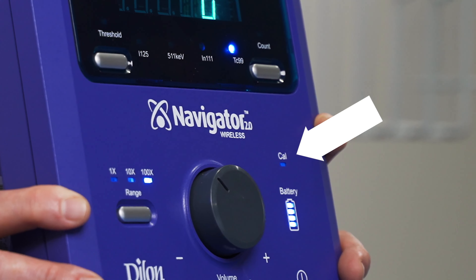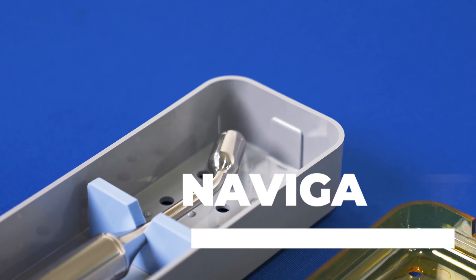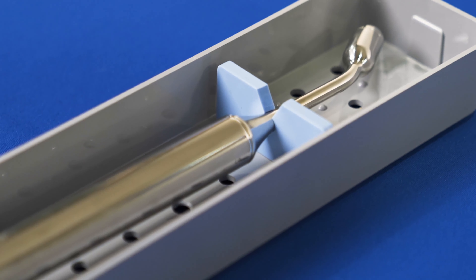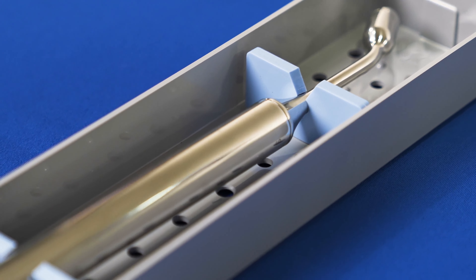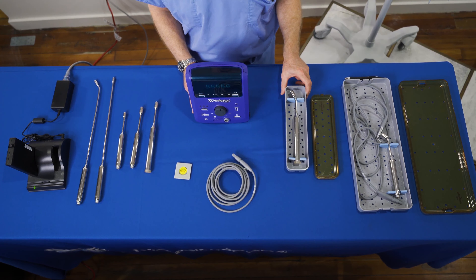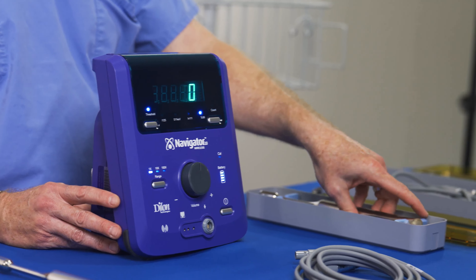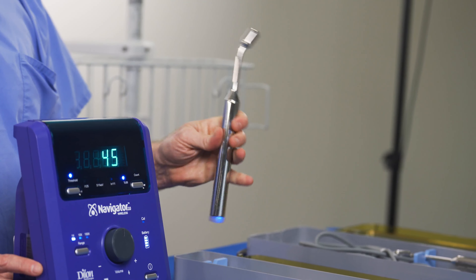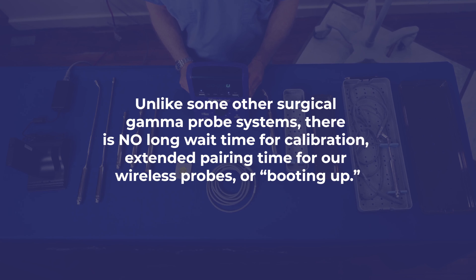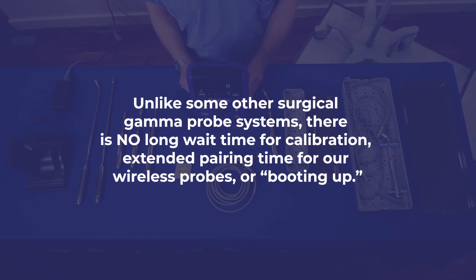The test indicator light is used only when performing a test check and not during a procedure. In order to comply with standards of accrediting organizations such as the Joint Commission and the CDC, critical devices such as surgical gamma probes are sterilized at central processing. The wireless probe will typically come to the operating room in a sterilization tray. Turn on the control unit by pressing the on button, then remove the sterile probe in the sterile field. Give it a light shake so that it links to the control unit. The settings on the control unit are preset, so you are ready to go instantly. Unlike some other surgical gamma probe systems, there is no long wait time for calibration, extended pairing time, or booting up.